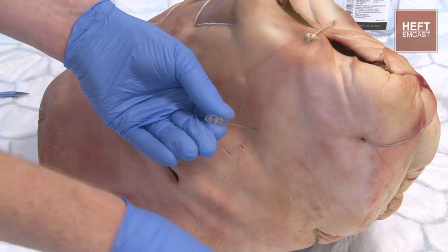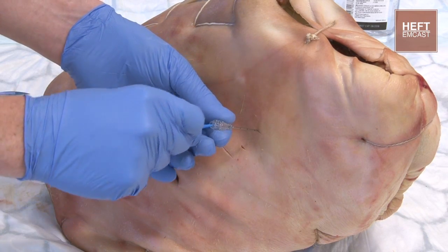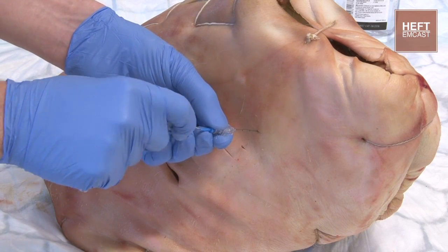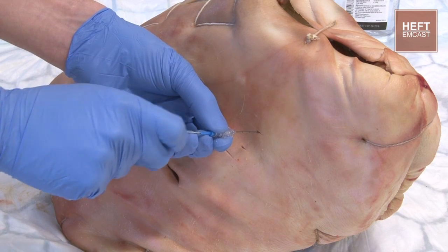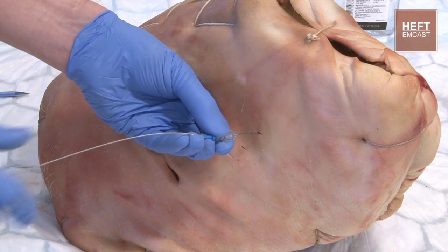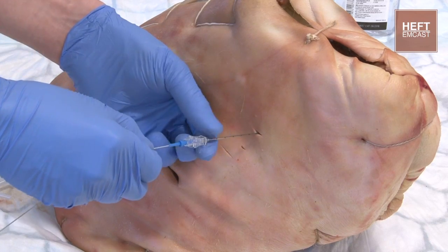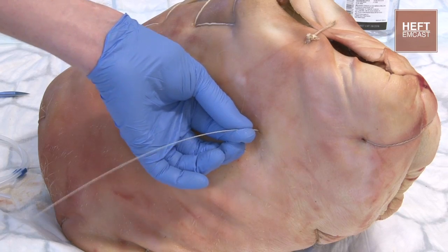Disconnecting the syringe, holding onto the needle. Then we're going to get our guide wire, place that in and advance that into the chest. Keep your hand on the guide wire all the time. Take the needle out and get rid of that.